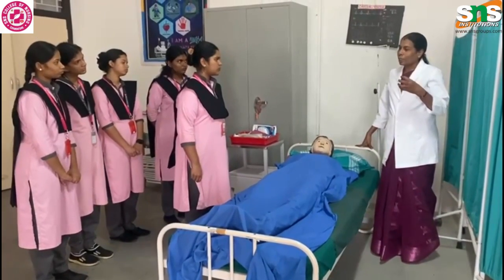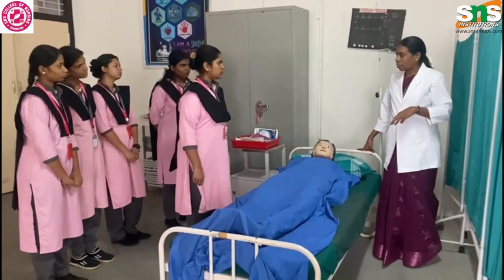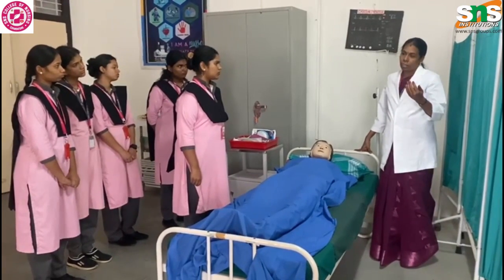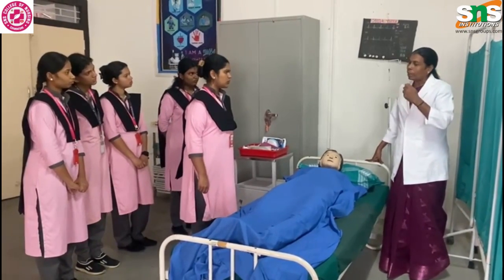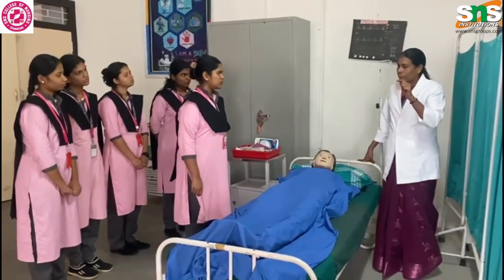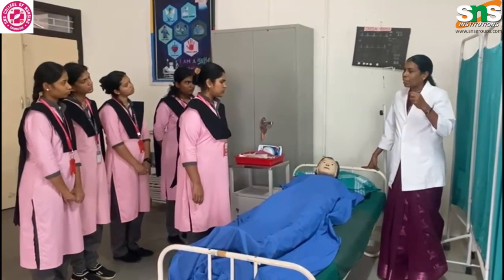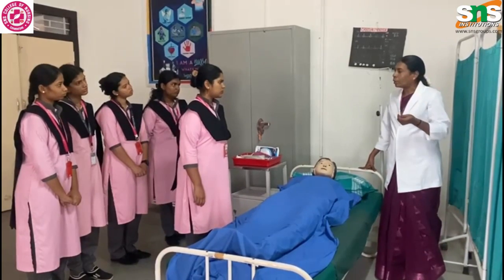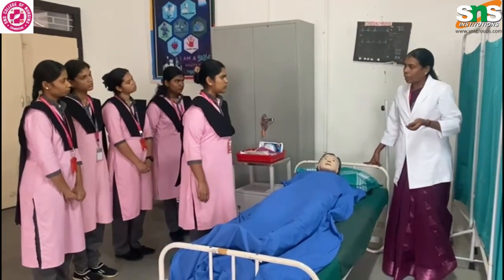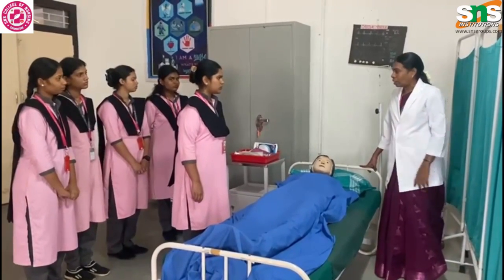Because in some cases the tube is damaged and the balls go inside the stomach. So the balls are banned. Instead of balls, they are keeping some holes. By seeing the X-ray, the holes are present on the tube and also in the stomach. If the tube is displaced, we can't see the holes or the balls. So by that we check whether the tube is in position or not.